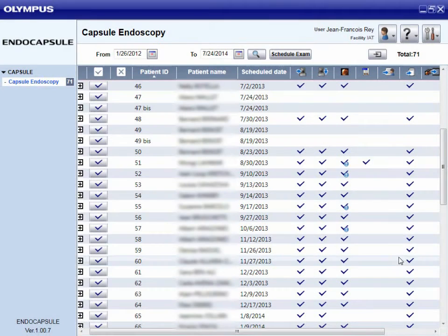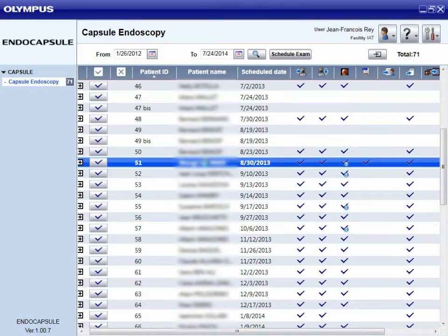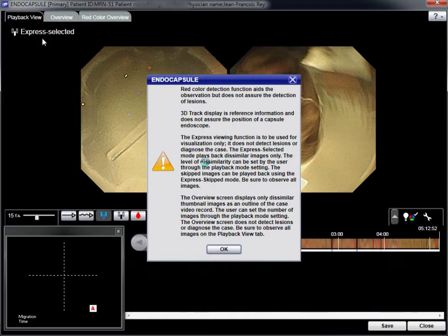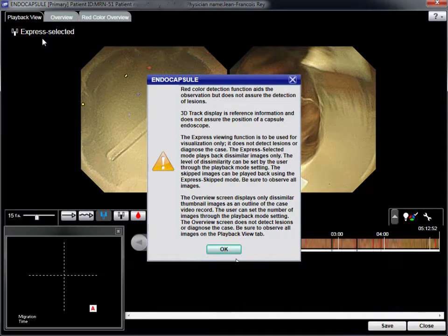The first step is to select the name of the patient from the list. This screen displays all of the features of the reading software, with the most useful for diagnosis being the express-selected mode.